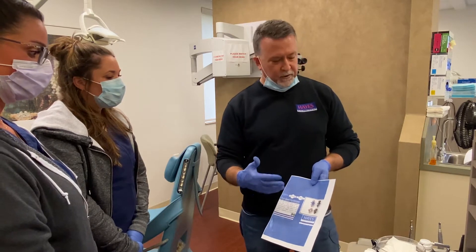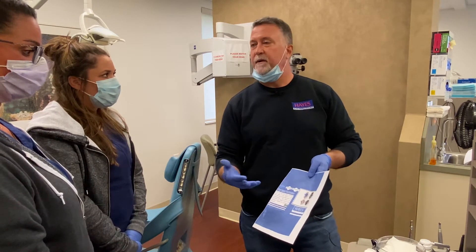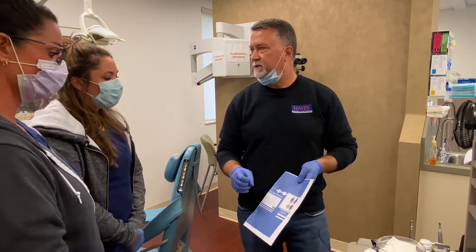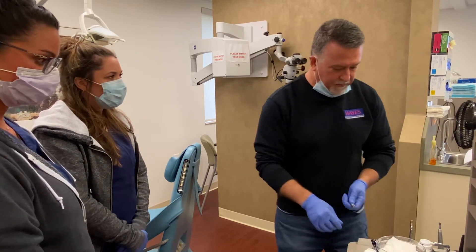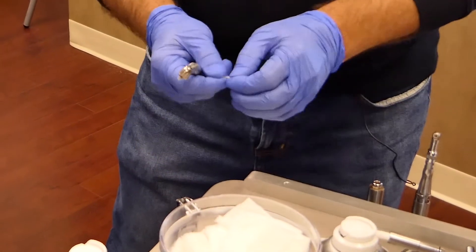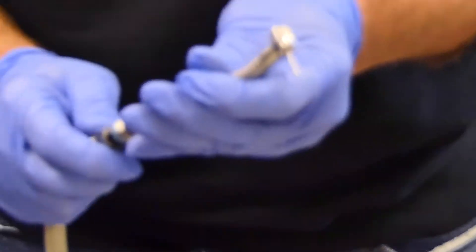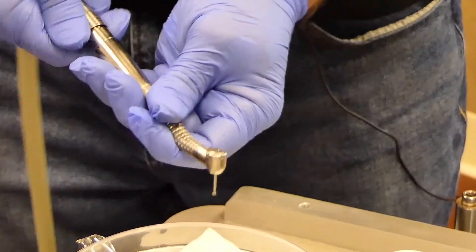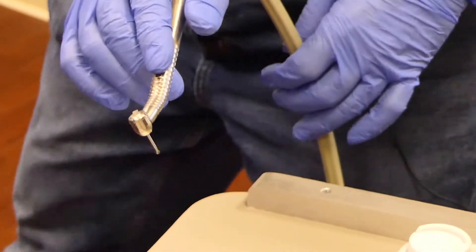Our whole goal with lubricating and purging the handpiece is twofold: we want to lubricate the bearings because they're running at about 400,000 RPMs, and we want to get rid of the debris that builds up in the head. So we've lubricated the handpiece — now prior to running it I'll put a burr into the handpiece, hook it onto the hose, and keep it in a downward fashion so the lubricant doesn't drift back down into the hose.